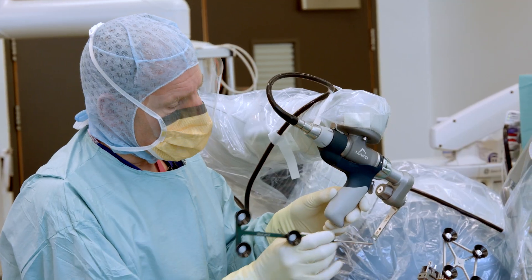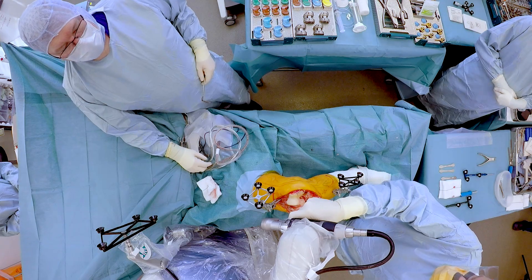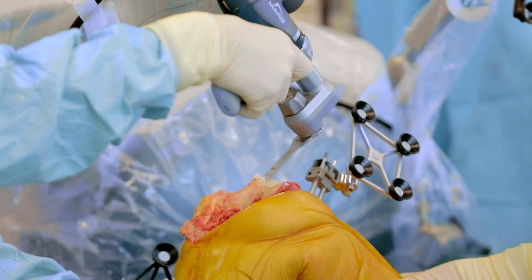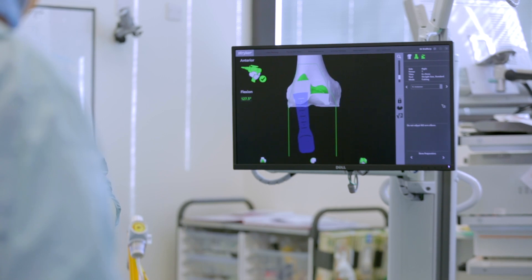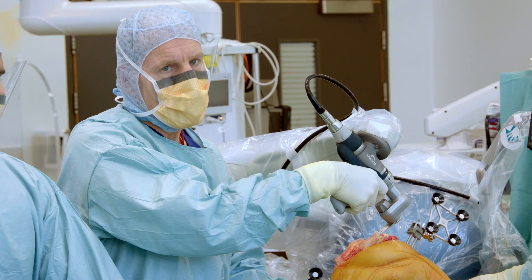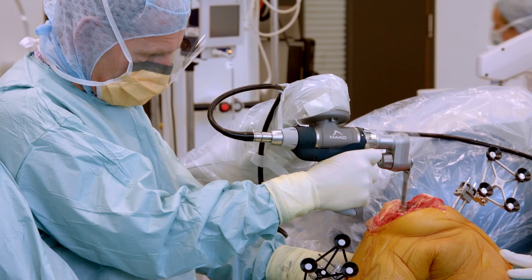We're making sure the robot knows where the knee is and where the saw blade is, so it can now execute because it knows where the leg is, where the knee is, and where the saw blade is. As opposed to normal surgery where you watch the knee, this time I'm watching the screen. As you can hear, when it suddenly stops, it's telling me that I can't do what I'm about to do — that's the beauty of the robot. It stops me doing things that shouldn't happen; it's preventing me from doing the wrong thing. I'm an experienced surgeon — I've been putting knee replacements in for 20 years.